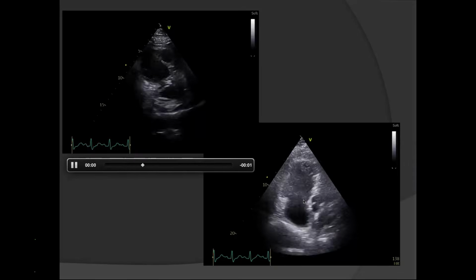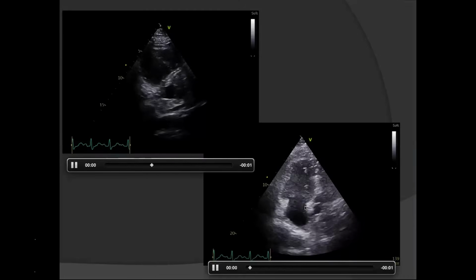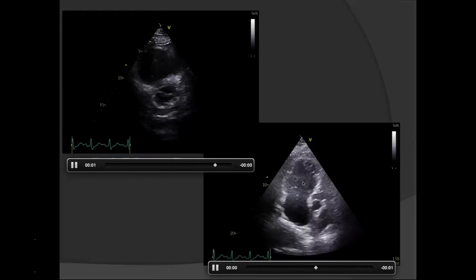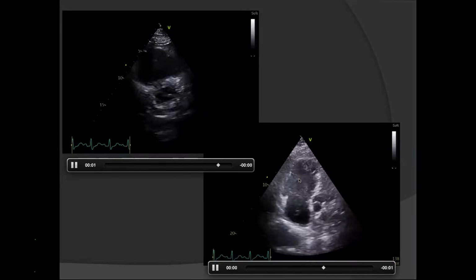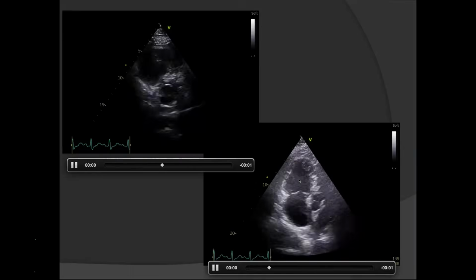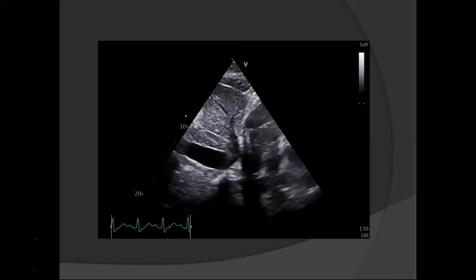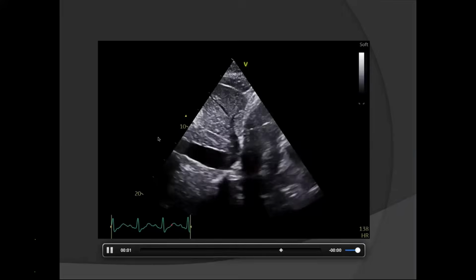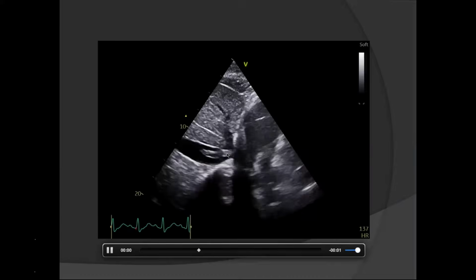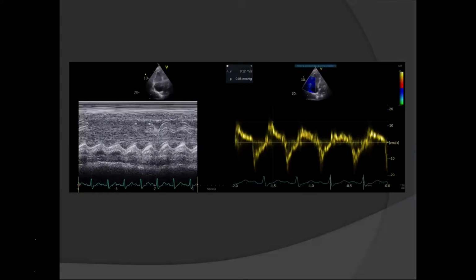And in this view, again, you can see this moving around of a thrombus burden in the right atrium across the tricuspid valve. It is prolapsing into right ventricle already. Pieces have already broken and gone into the lung circulation. So this is more embolism waiting to happen. IVC view, again, we can still see some thrombus left in IVC coming from the deep veins, further embolizing through the right heart, causing pulmonary embolism.